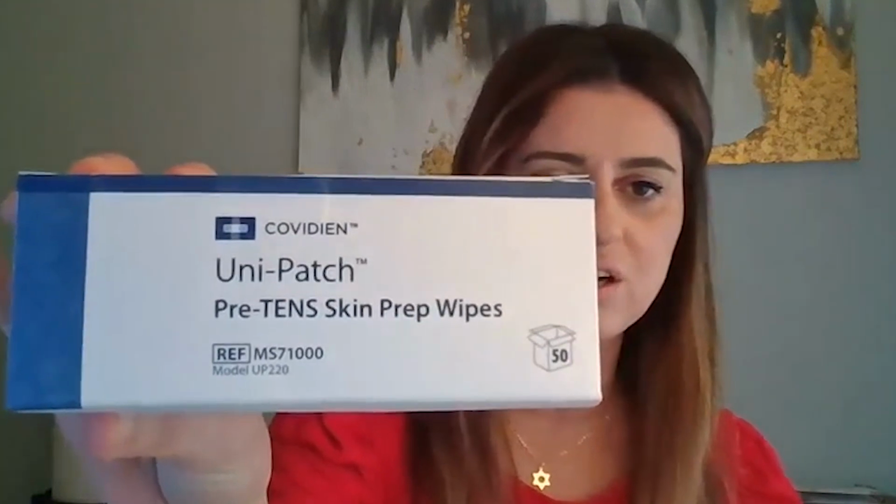Can I jump in with a little tip for the Cefaly? Absolutely, you can. For anybody who uses Cefaly and finds that these strips peel too easily, I love these little prep wipes. I'm obsessed with them. They come in a little packet, and you just wipe your forehead, kind of like an alcohol swab, and the stickies stick so well. You can do headstands with it. It will not fall off. I wanted to say that for people because I know many have an issue with the stickies peeling off. They were actually recommended by the Cefaly team.